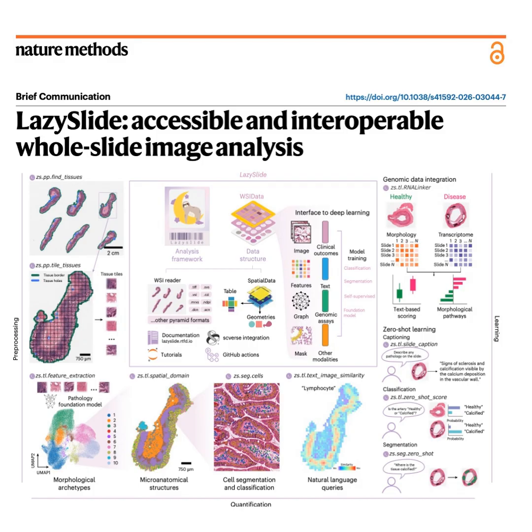And to execute this integration across two entirely different types of data, they use something called MoFA, right? Multi-omics factor analysis. Yeah, running it through the muon framework. MoFA is a statistical model specifically designed to infer latent factors that are shared across multiple data modalities. So it looks at the variance in the visual feature matrix and the variance in the RNA gene count matrix and extracts the hidden variables driving both. Exactly. And what MoFA extracted was profound.